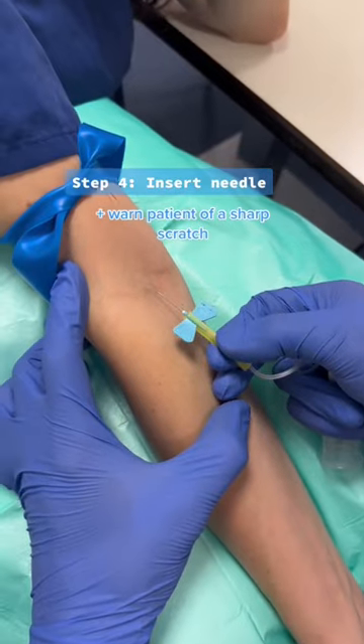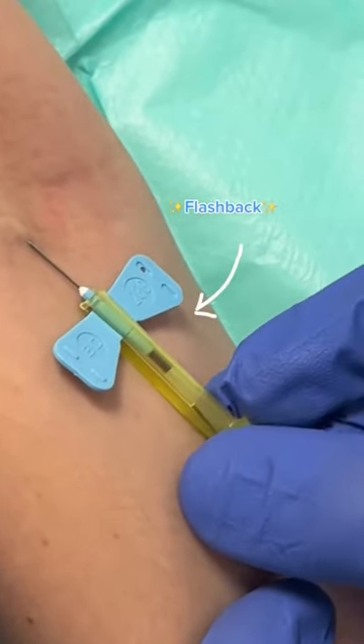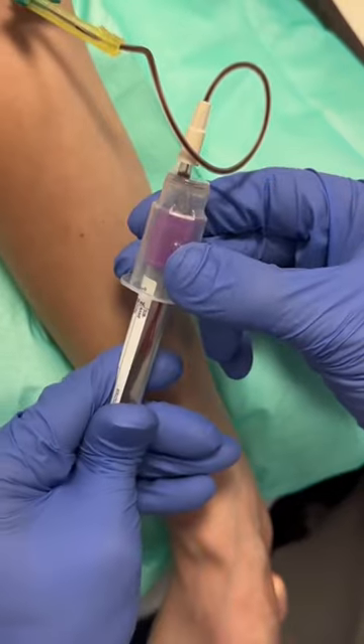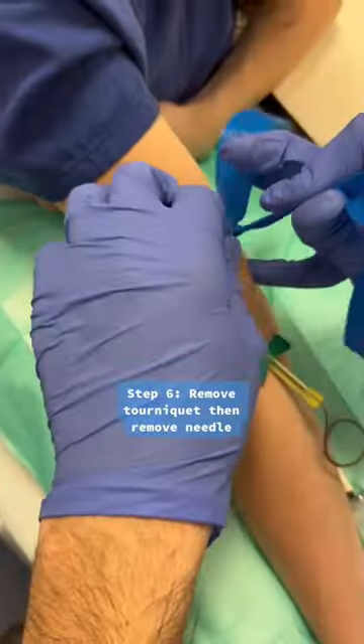Then you insert the needle at a 15 to 30 degree angle, making sure you're anchoring the vein from the start so it doesn't move about. Once you witness flashback, you know you're in the vein and you're ready to collect some blood. Put in the blood bottle into the vacutainer, and because of the negative pressure, this fills up the blood bottle. Make sure to fill it up to the line.